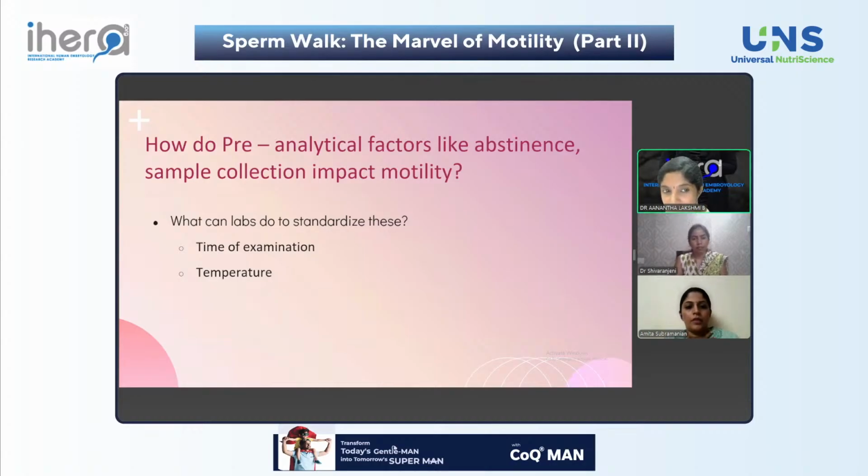Sir, I have a question on the standardization. Do you advise any kind of incubator is a must for an andrology laboratory, or a test tube warmer to maintain the sample after semen collection at 37? Suppose if you're not having one, is it fine or not? No, it is fine.